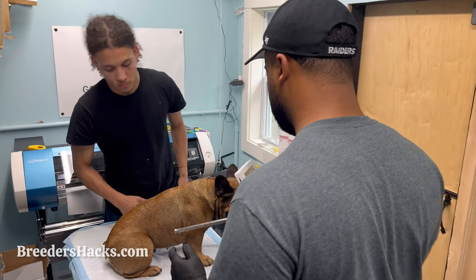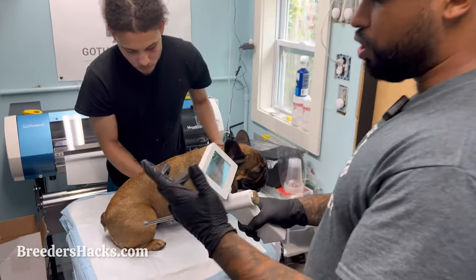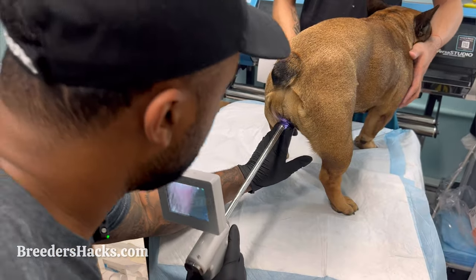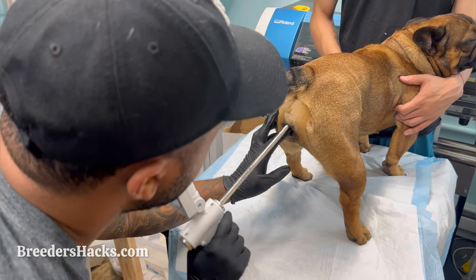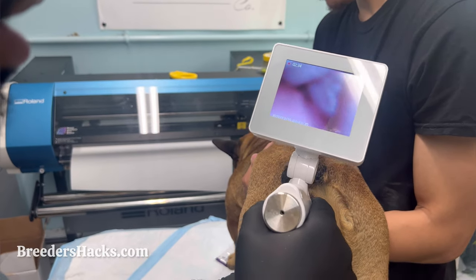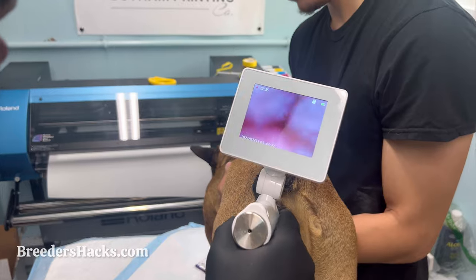Hold her steady. I'm going to hit the record button, insert my finger like this, go up and over, and use the endoscope to follow. As you can see, you're going to keep following through — just follow that channel. Once you get to what looks like the roof of a mouth, I'll show you exactly what you're looking for. There's a little button on the gun itself that allows you to push air through tight spaces. Just follow through and keep going.